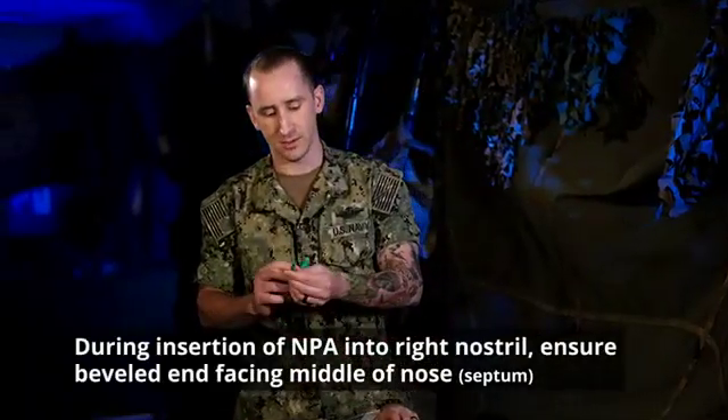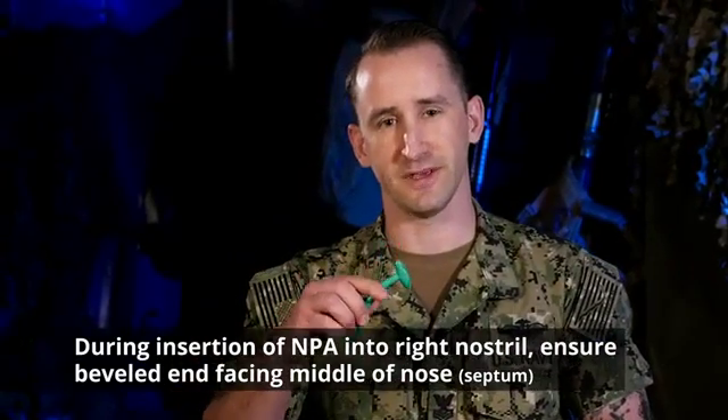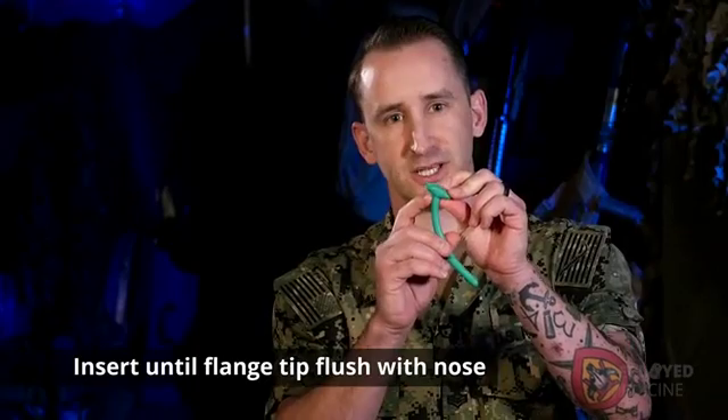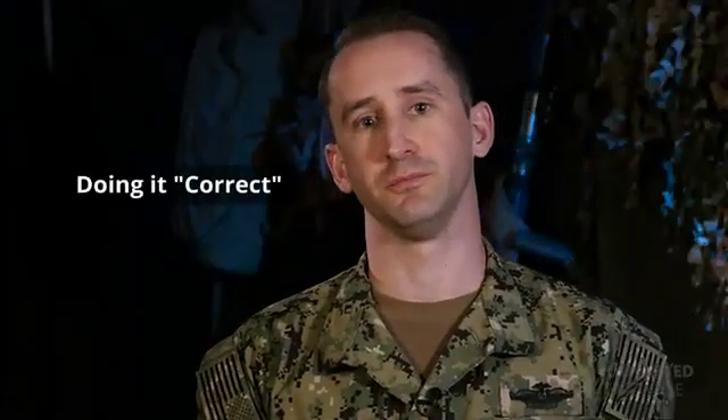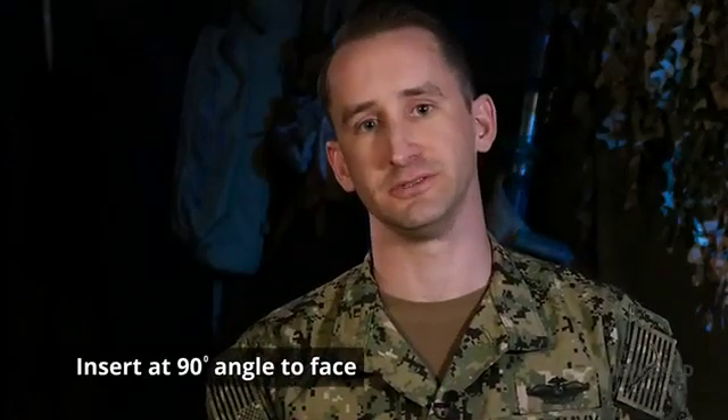When inserting the NPA, you want to make sure the beveled end is towards the middle of the nose, facing the septum. You're going to insert it until the flanged tip is flush with the nose. One of the most important things to remember is to insert it at a 90-degree angle to the patient's face.